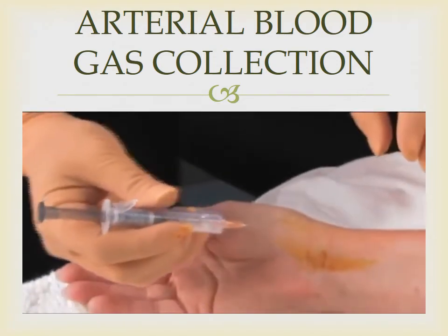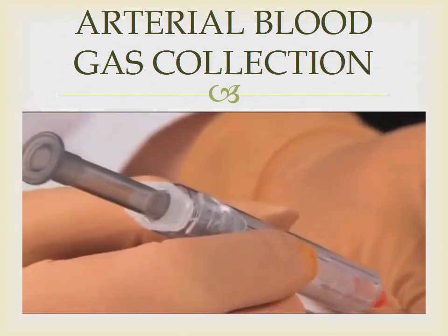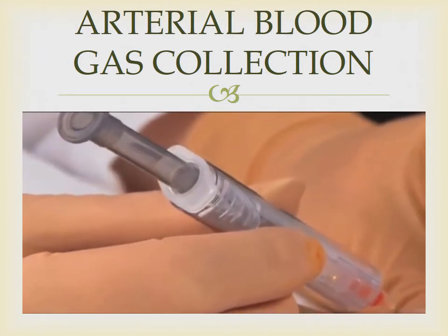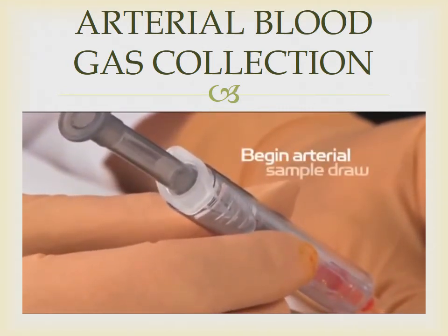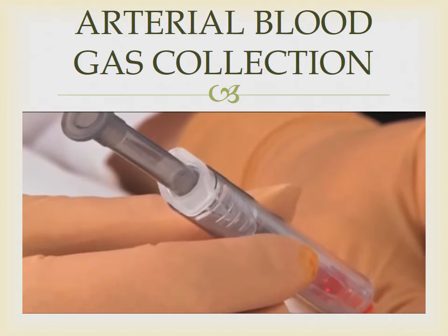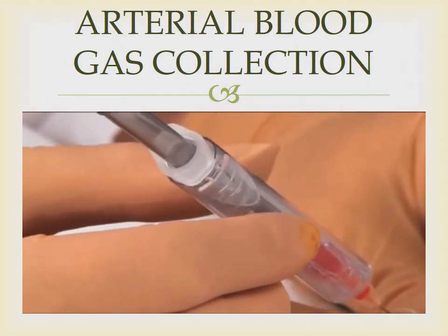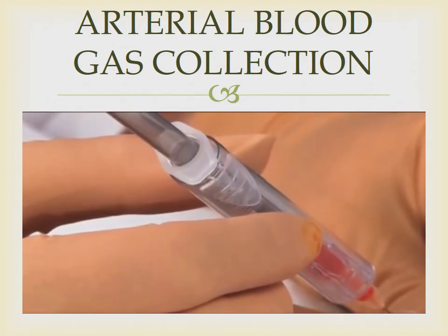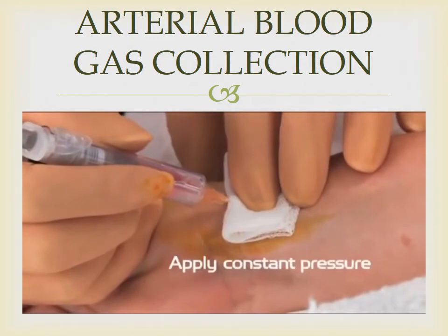The needle has a surgically sharp, short bevel to minimize the potential for opposite arterial wall puncture and offers a faster fill time. This makes the arterial draw as comfortable as possible for the patient. Begin your arterial sample draw. Adjust your line of sight to look over the needle hub for a better view of the blood flash if needed. Once the sampler is full, remove the needle and apply constant pressure to your patient's arterial puncture site.